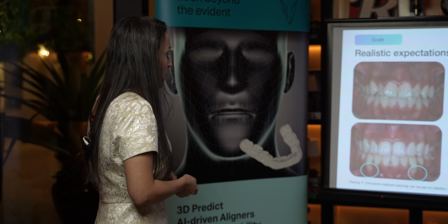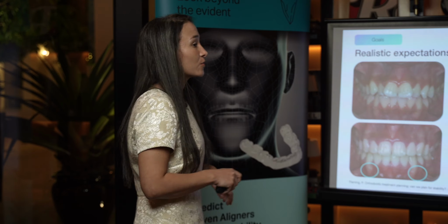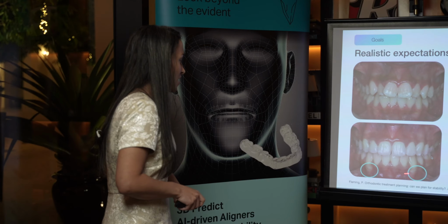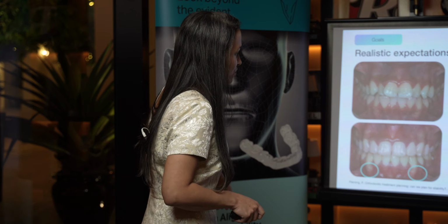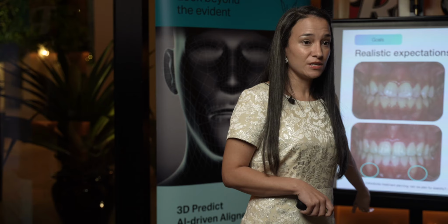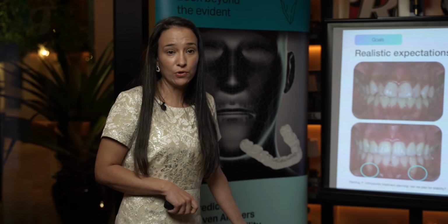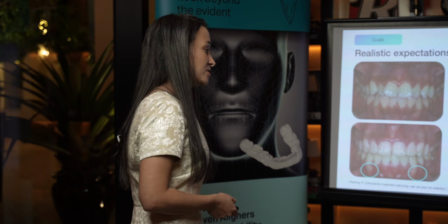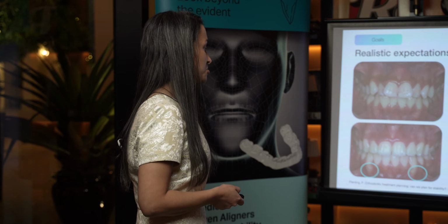There's no bone here. No bone. And the reason why you are not seeing gingival recession is because this treatment was completed within 5 to 10 years. After 5 to 10 years, you're gonna start seeing gingival recession because the gingiva follows the bone. We all know that. And then this patient is gonna have some perio implications. Maybe he's gonna need perio surgery.